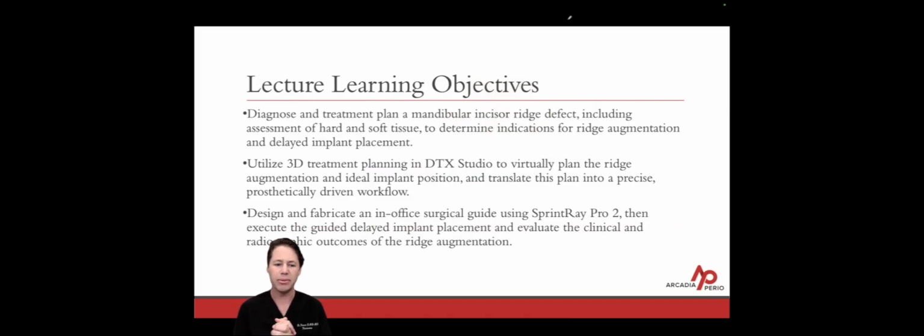Finally, I want you to be able to design and fabricate an in-office surgical guide using the SprintRay Pro 2, then execute the guided delayed implant placement and evaluate the clinical and radiographic outcomes of the ridge augmentation. So sit back, relax, and let's spend about 10 to 15 minutes with me going over this case.